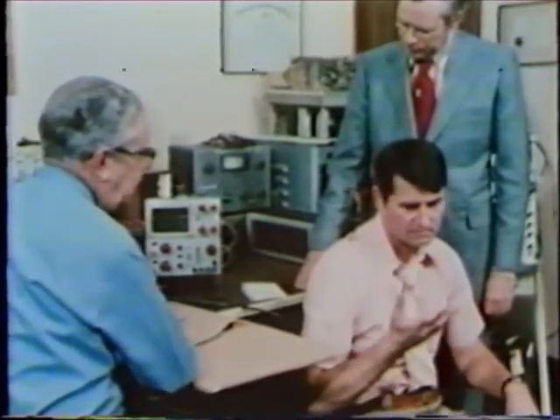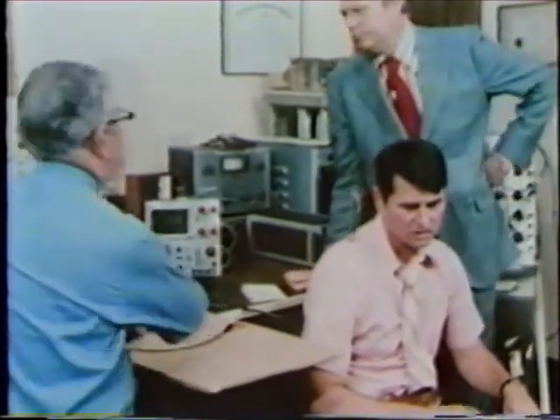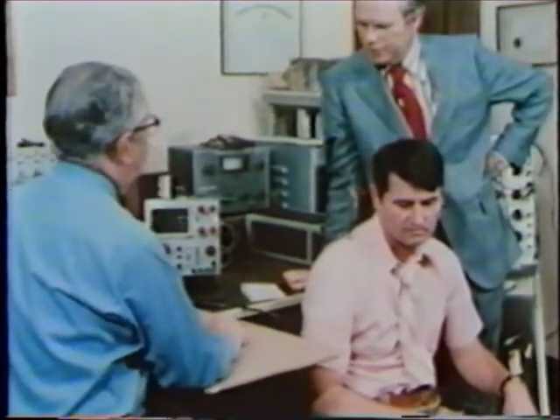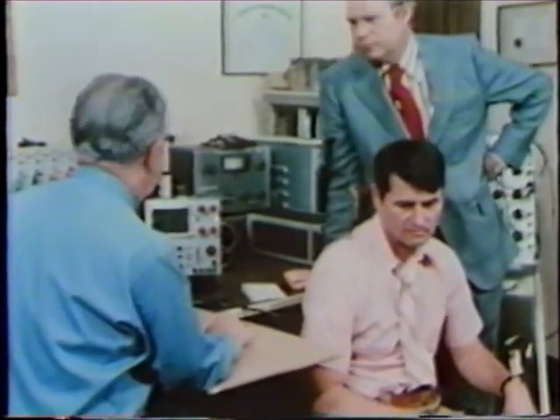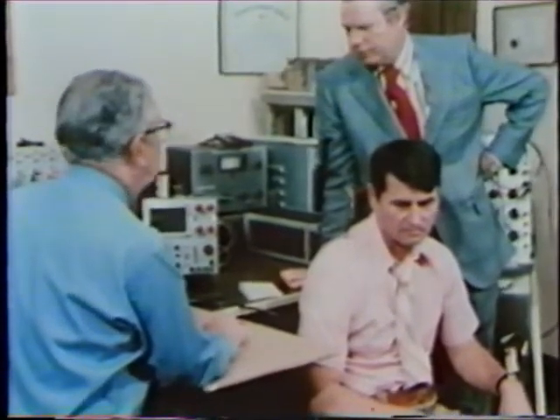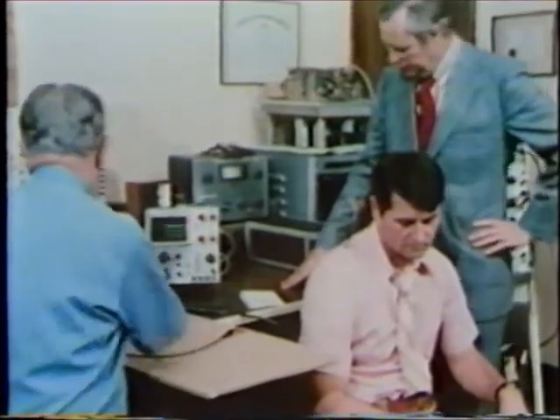We found that putting in a 16,000 cycle stimulus in one electrode and a 1,000 cycle stimulus in another electrode allowed him to hear a response for the 1,000 cycle stimulus. This has proven to be a very important observation. We feel that the high-frequency signal somehow sensitizes the inner ear to signals in the speech range.